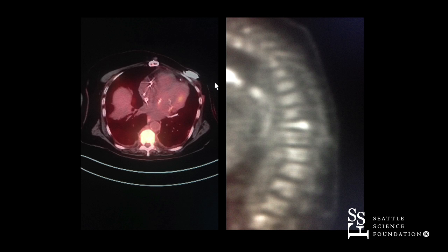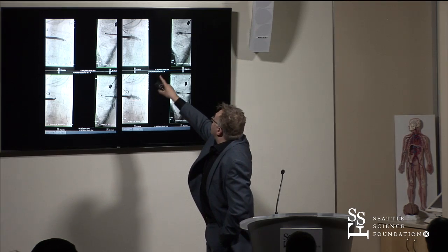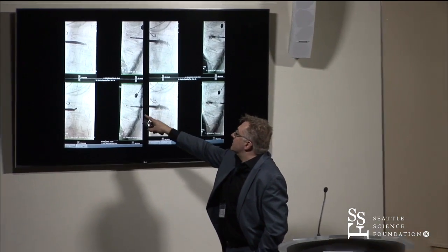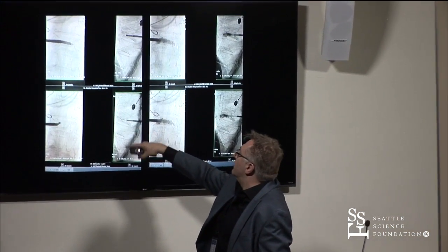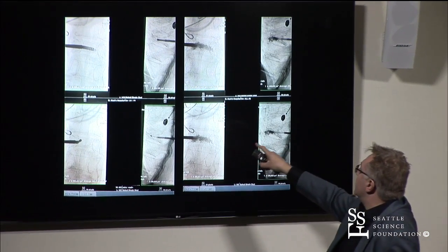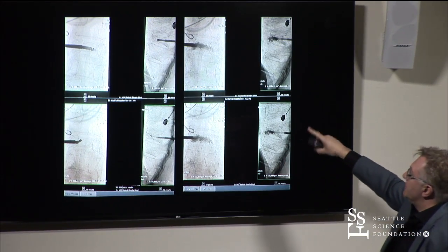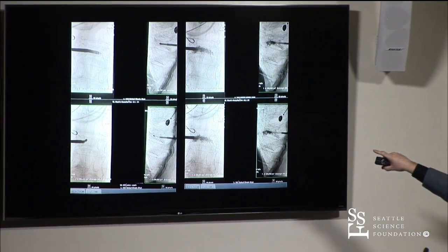There's the PET scan — bright lesion on a really bad lateral view. We're going in with the osteotome, directing it wherever we want, and getting a really nice result. Here's the probe extended — we're getting pretty nice filling with cement.